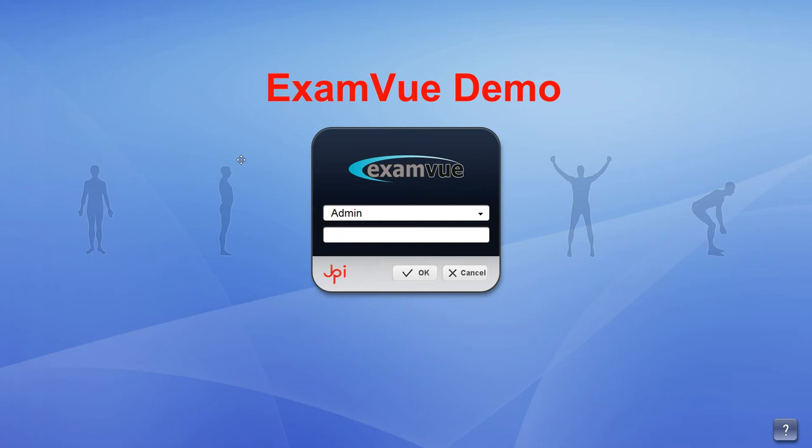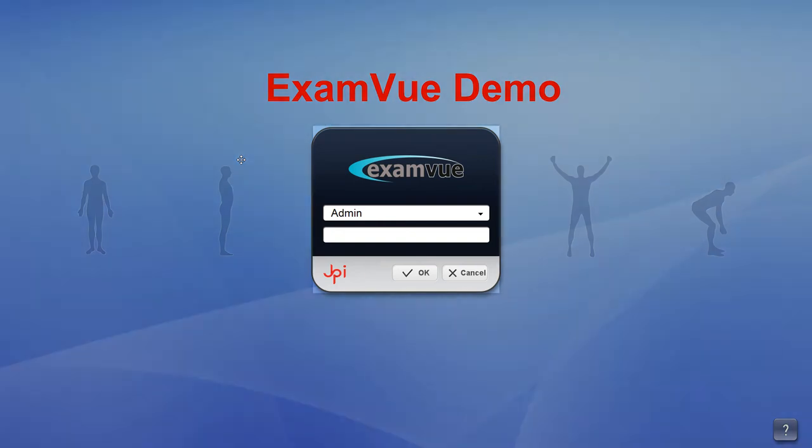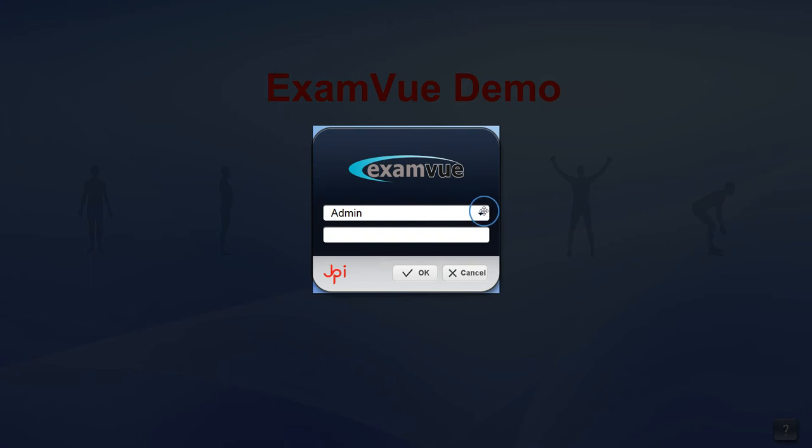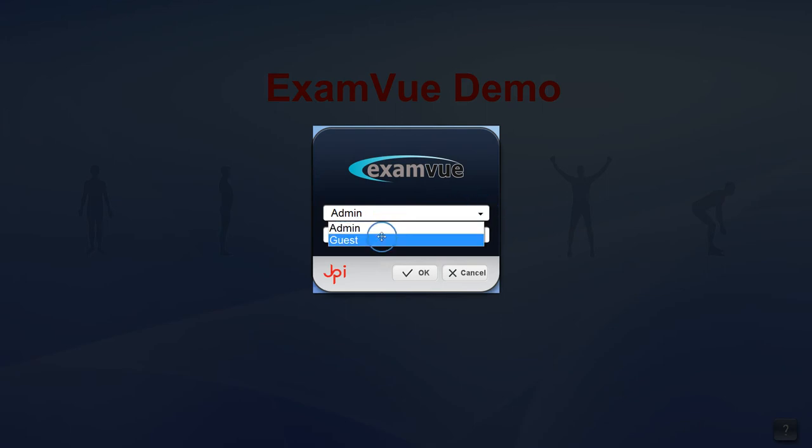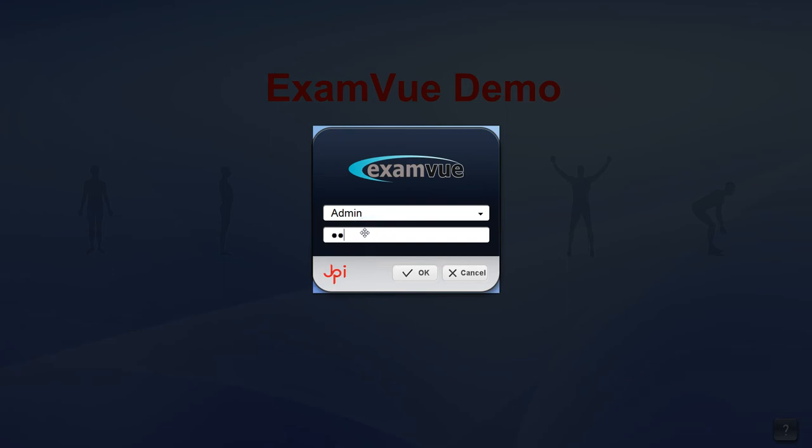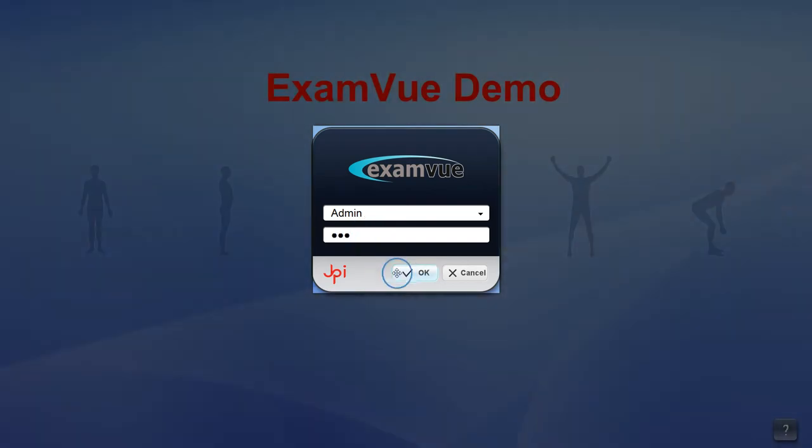You can set different account logins on the configuration menu. I'll be using the admin account to log in. Once you're logged in, you'll be on the registration screen.